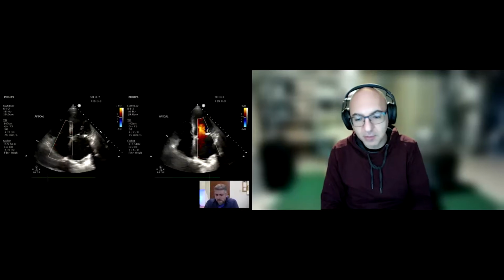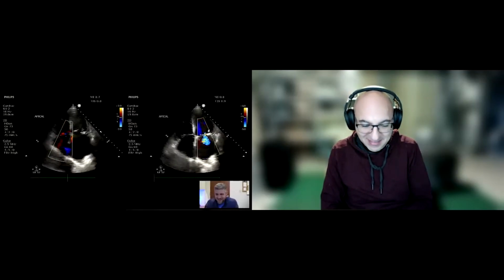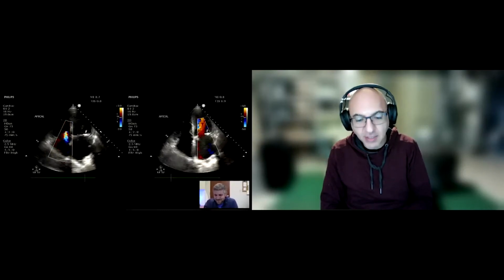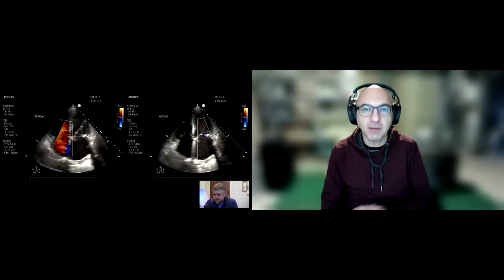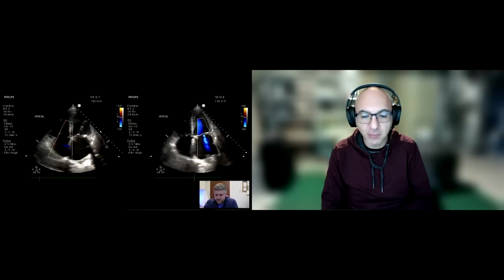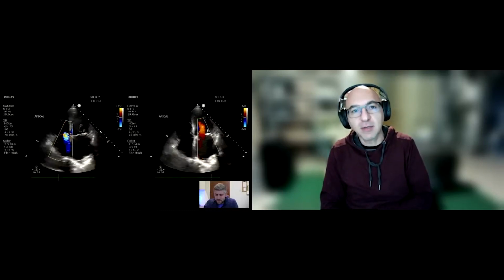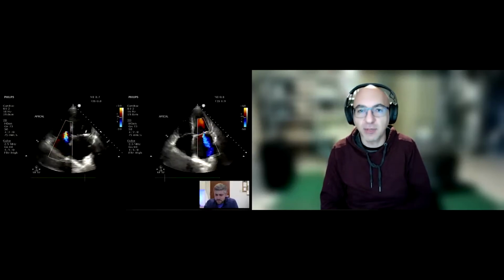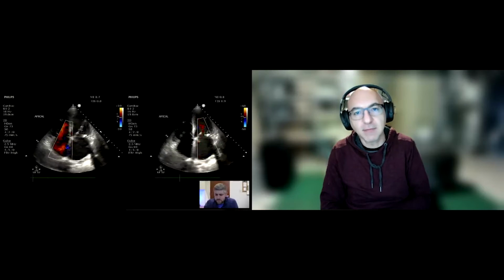Yeah, I looked up the numbers before we started. It's 1.9 or less for the lower range, if there is variability of more than 50% with a sniff. The American Society of Echocardiography also mentions you can use 20% variability with tidal breathing, which we never really look into because we say sniff.